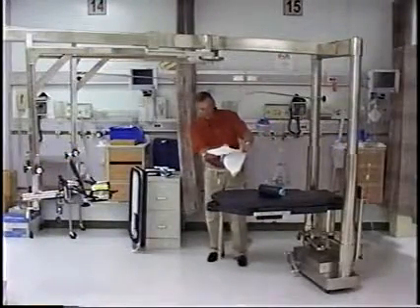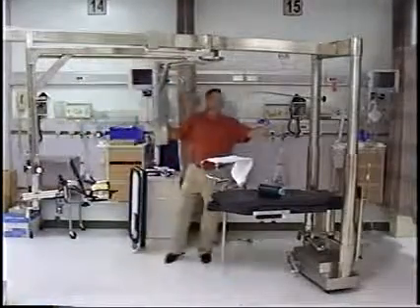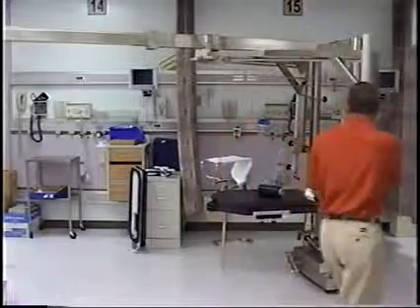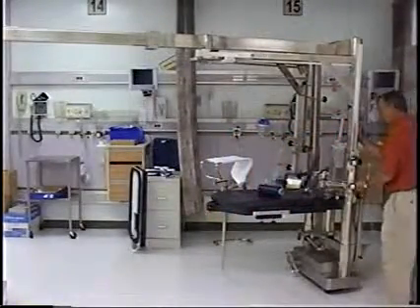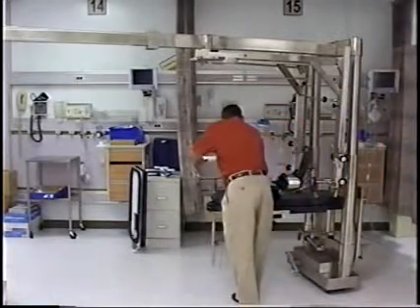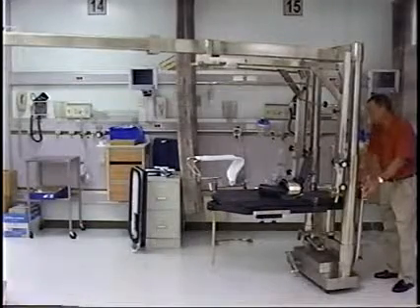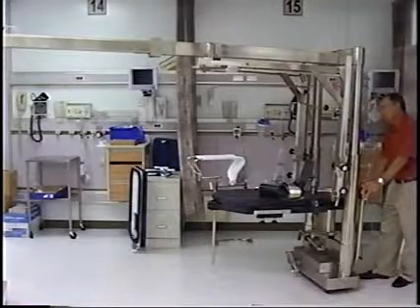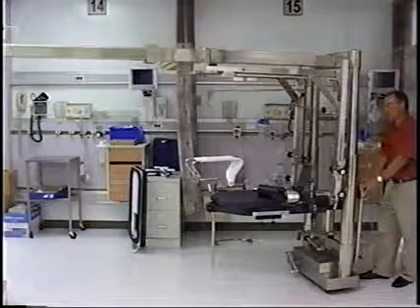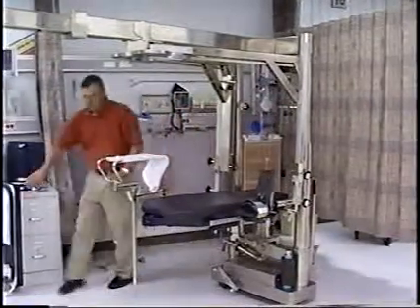Okay, remember this articulates, so I would put this in this configuration. I bring this spar around, put it here. Bring this spar around, hit the lengthen and shorten and move it in so it's just past the lifting collars but not touching them. And then we lower the table. As you're doing this, make sure that this hammer doesn't hit the top. And set right on the edge. This goes up here.